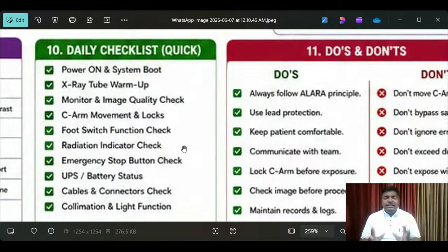See, all this information took this much time. I started the live session at 5 o'clock, and now it is 6:44. Okay, it is going to 2 hours. See, this much information I'm giving in a practical way. If you want to be perfect with this equipment, it takes 1 year, 2 years. Understand? Even then, if you maintain it properly, only within 1 year will you be perfect in this equipment. Because whenever we get a complaint, we can't just imagine; only then do we have to operate the equipment and resolve the issues. That is the reason experience is very important in this biomedical engineering field.